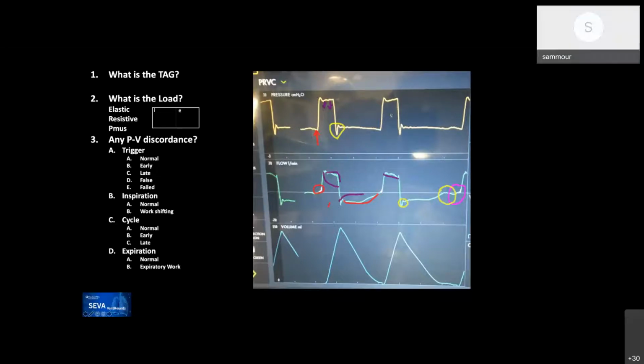I don't know about that. I think it's just noise. I see this with kids with low compliance all the time, and the noise is even worse with those smaller tidal volumes. I think that part about low compliance is definitely an issue. I mean, it's still an artifact. And in fact, I've had it severe enough that it actually causes a false trigger. Sometimes it reverberates so much it goes slightly above the baseline.